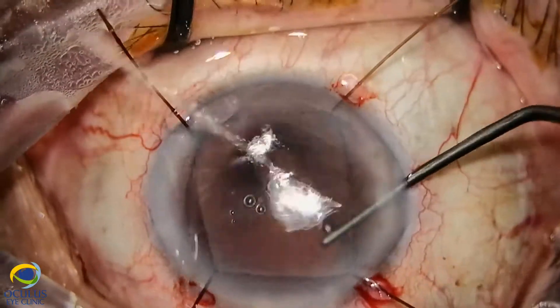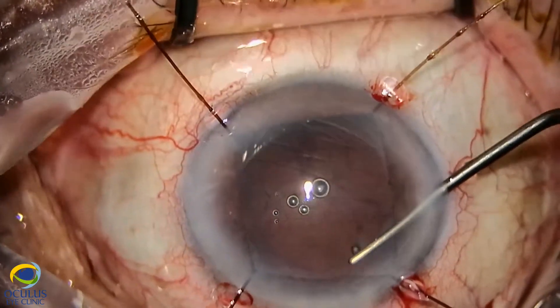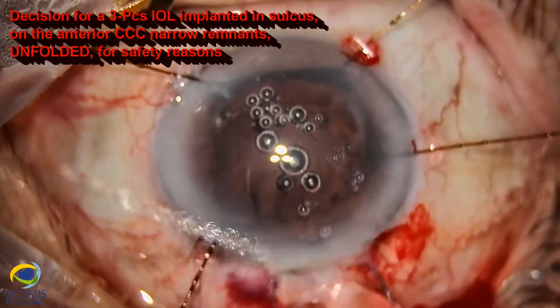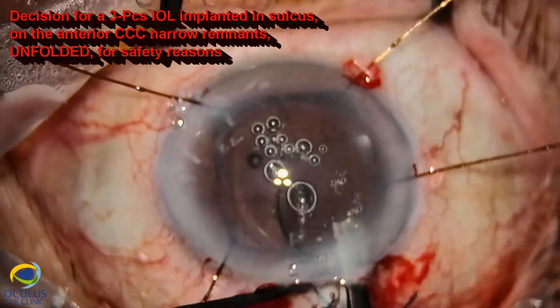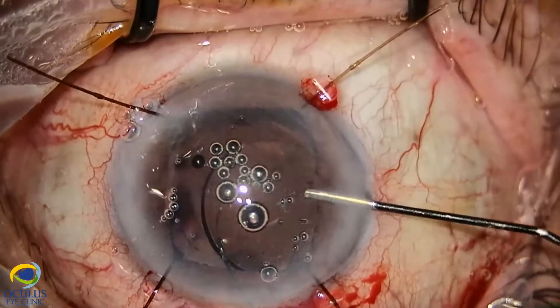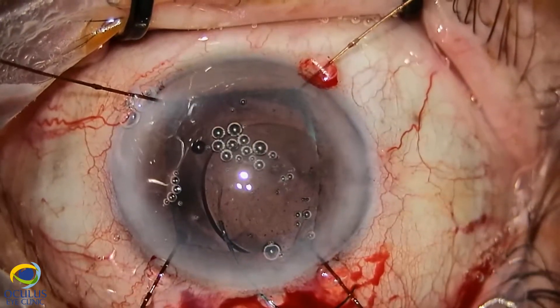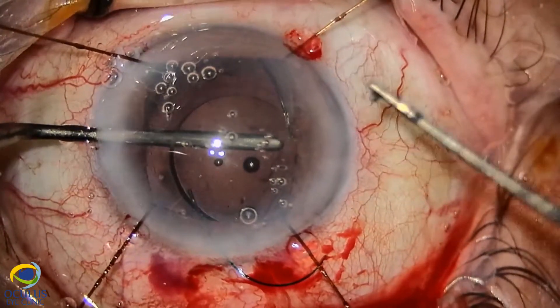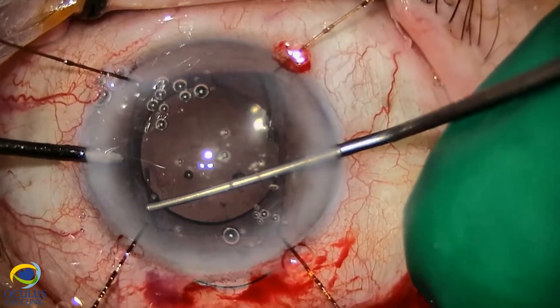We decided to place four iris hooks in order to better visualize the periphery. Even though we were implanting a foldable IOL, we preferred to enlarge the limbal incision to six millimeters and to implant the IOL unfolded, as we believe this is a much safer and more controllable implantation.